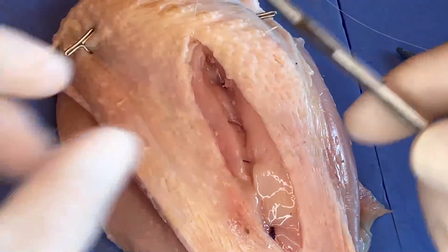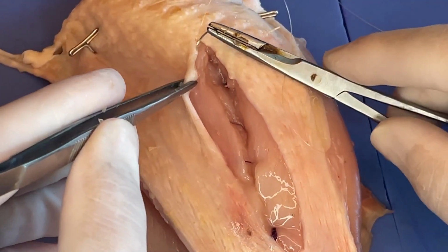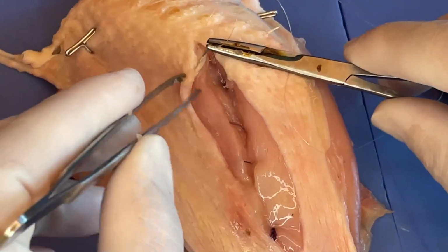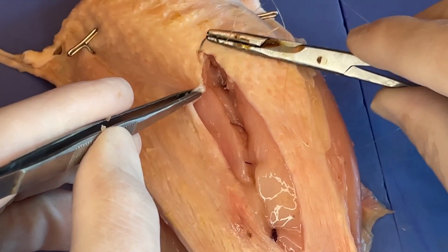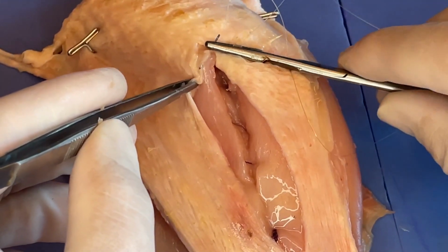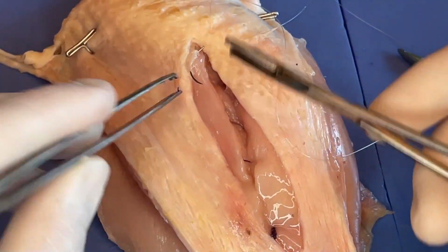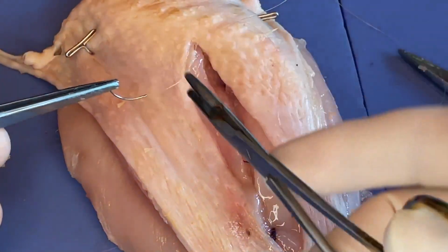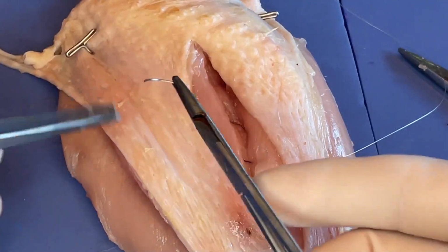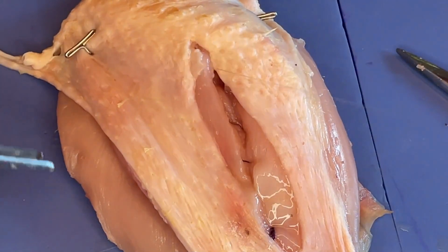All right, so what we do for the subcuticular is we're going to be passing immediately under the skin edge, and we're going to be traveling parallel to it. So we would come in here right at the apex and then pop out there. And again, because this is chicken skin, and especially as this has gotten a little bit warmed up, the skin's separating from the meat underneath just a little bit.